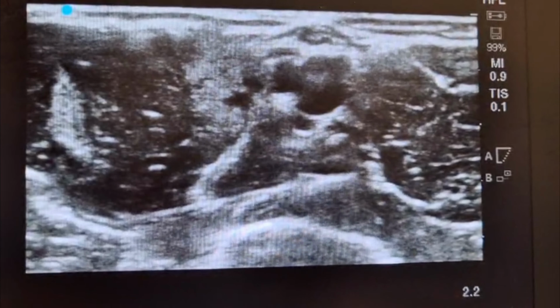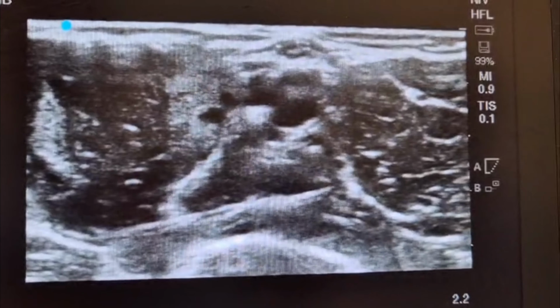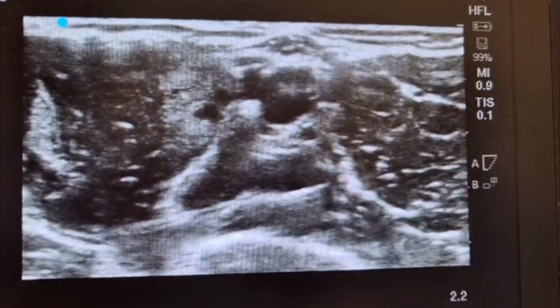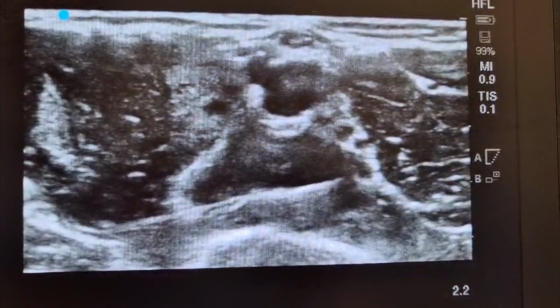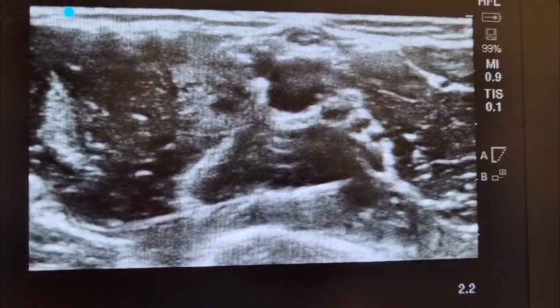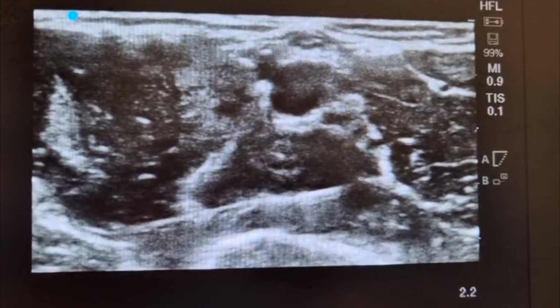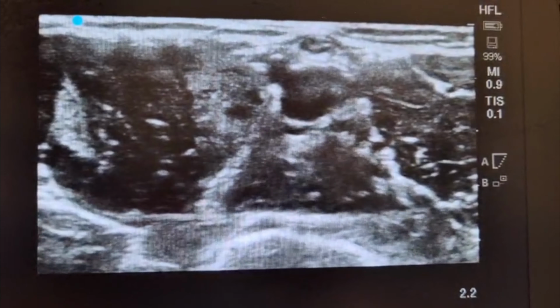If anything white, I would question whether to inject, because the nerves look a bit whiter here. I could see on the tip of your needle, I could see the round thing get pushed out. Okay, that's the nerve. Now you could see it clearly, yeah? The nerve's getting pushed out. Okay. Can you go under that nerve? Yeah. Under. Fantastic. Great image. Very good. Okay. Under. Here's that layer.